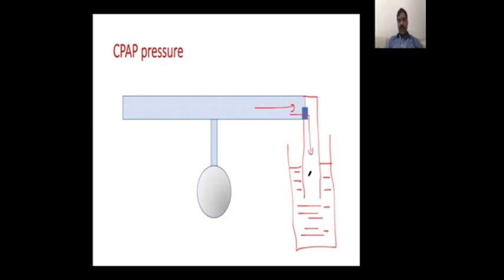Now the gas will flow into the tube. Till this level, there is no obstruction to the gas. Now from here, the bubbles have to come out. So they have to go through this water column and come to the atmosphere. So instead of having obstruction like this, we have created another obstruction by putting the expiratory limb inside water. Now the resistance we created is equal to the depth of immersion of the tube from the level of water, how much this tube is inside water. That is the resistance we have created for the flow of gases. So let's say this is 5 centimeters.